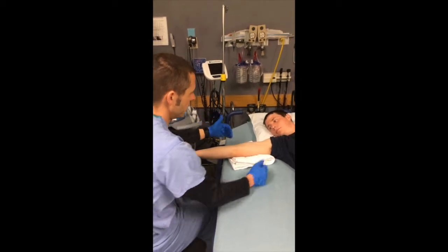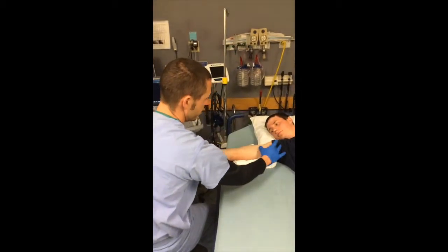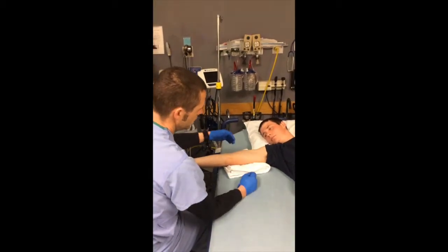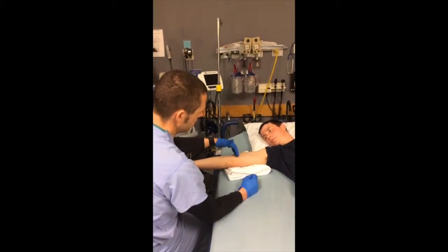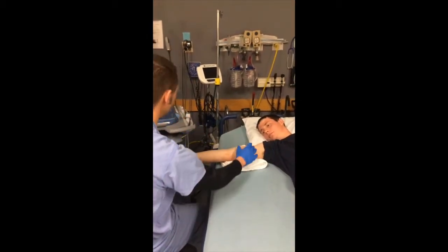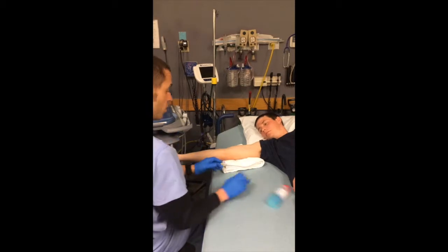When you're looking at the upper arm, if you can divide it into thirds, you ideally want to look at the center third. That way, a lot of times when you get in veins here and here, there's a lot of movement and the catheter can come out.